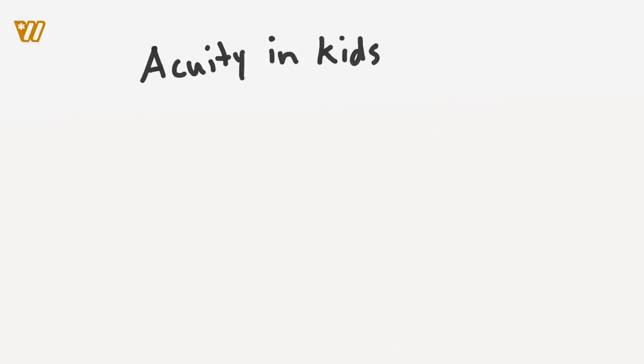Good, let's keep on going and talk about acuity in children. So how do we measure acuity in kids? Sometimes that's easier said than done. For those of you that have been in pediatric clinic, you're naming me some different types of acuity tests, and we'll get into those. A couple of ones we have here in the text are the birthday cake slide, tumbling E, and Landolt C. The key thing about these is they are all recognition acuity types. So outside that, you want to write recognition acuity.